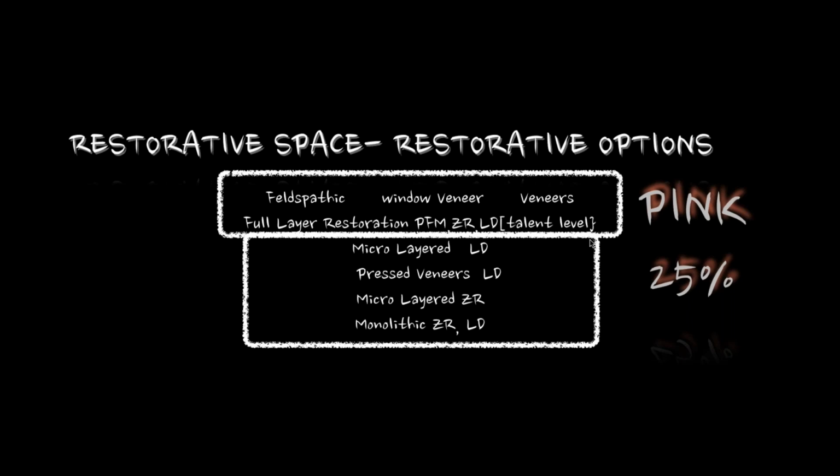Even if you look at my desk right now, that means almost 2.5 out of 10 pans have some sort of pink restorative that I need to do, whether it's a full arch of implants that I'm making pink on, or 2 or 3 units that I need to add pink on to. And that number has really increased.